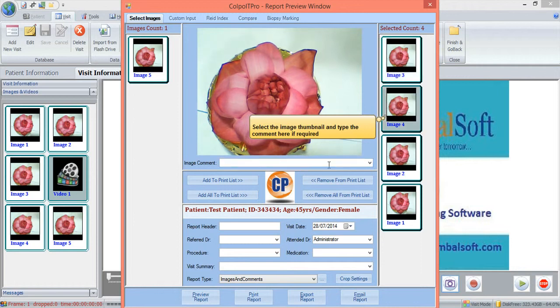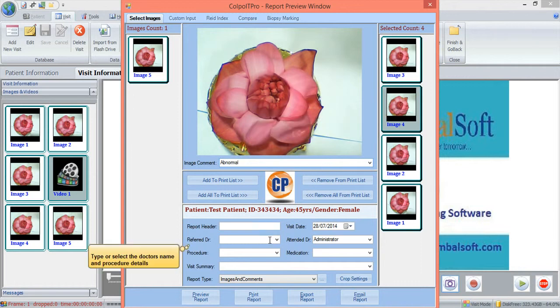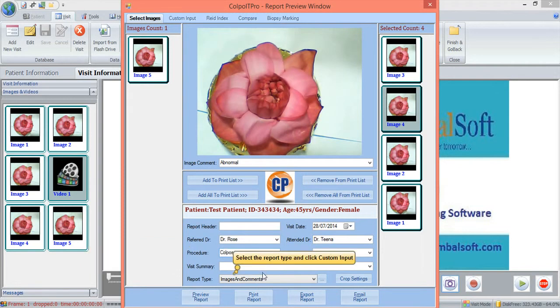We shall now move on to add some more information to be included in the report. Type in or choose the name of the referred doctor, attended doctor, and the type of procedure. Select the report type from the drop-down menu.